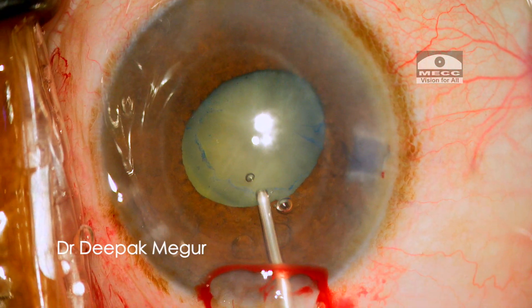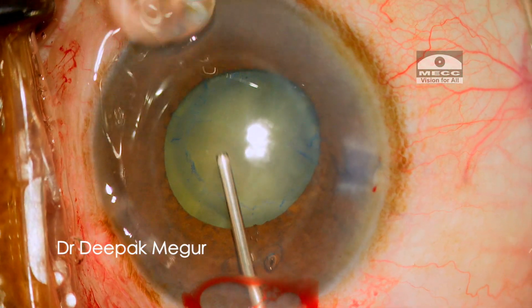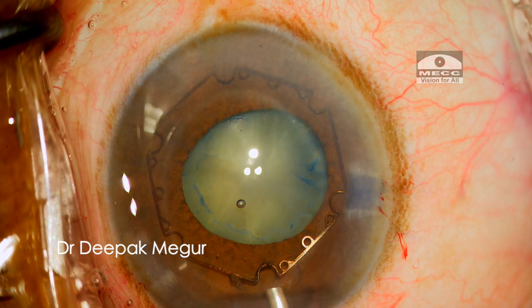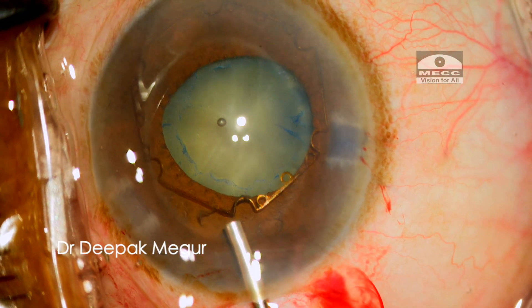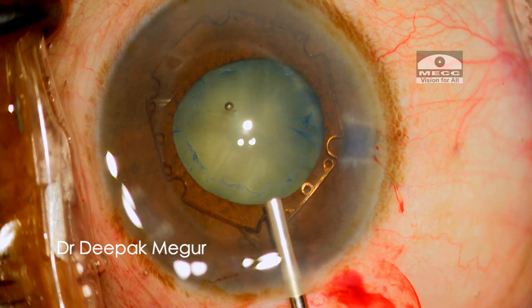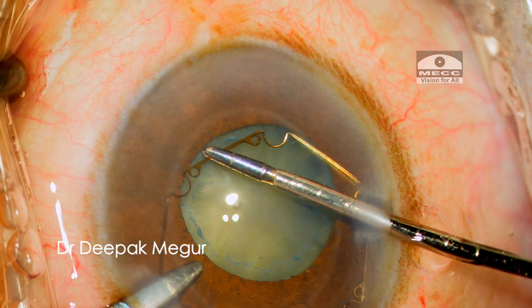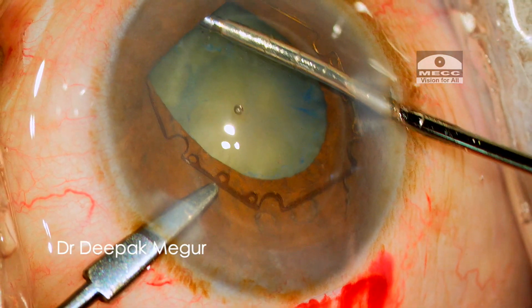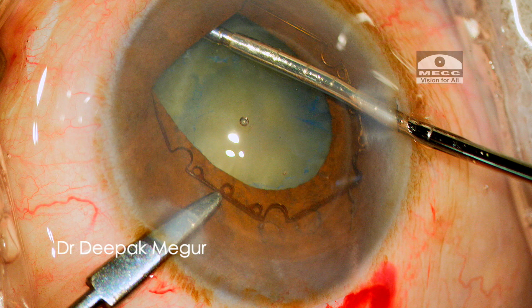The B-hex ring is gently introduced into the eye and placed over the iris. I prefer to use a standard protocol to insert this device. I use the B-hex micro forceps through the side port to engage the first pair of scrolls of the notches into the pupillary margin. Stabilizing the globe using a second instrument through the other side port is a useful trick to prevent the globe from being pushed out of the visual field during manipulation of the ring.